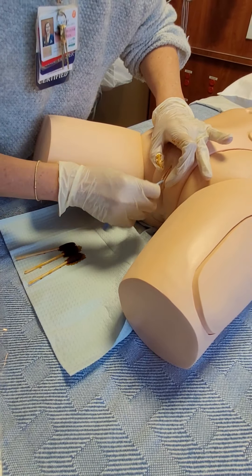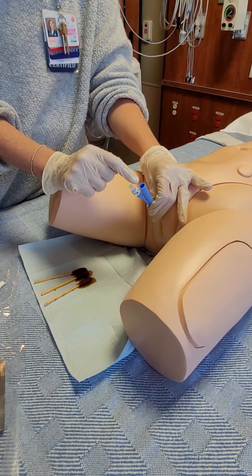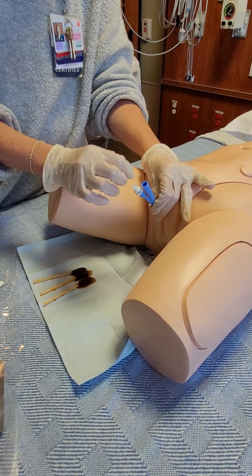The IR tech will have kind of a stop lock — it's blue on one side and white on the other, and it's just a valve. If yours doesn't already have one, you're going to plug that onto the end once you get the catheter in place. Then your IR tech is going to hand you the tubing, and you're just going to connect and screw the tubing on right there.